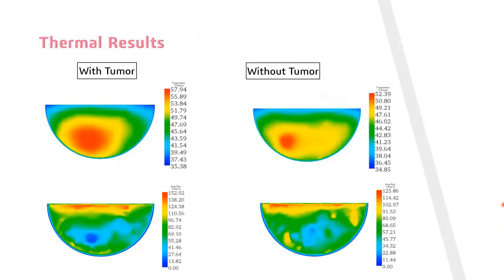HFWorks also allows you to analyze thermal behavior with a post-processing thermal coupling. We will study this antenna to investigate its thermal behavior by the detection of tissue temperature when an antenna excitation power of 1 milliwatt is used. The simulation revealed the following results of the temperature distribution and heat flux in the breast with and without tumor.